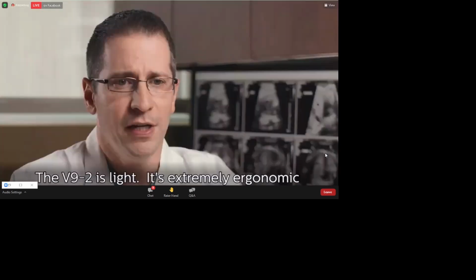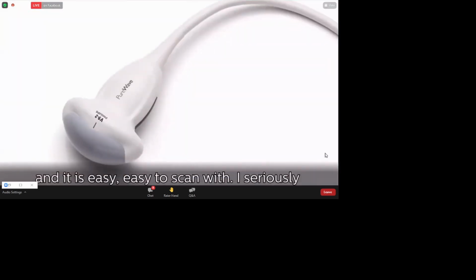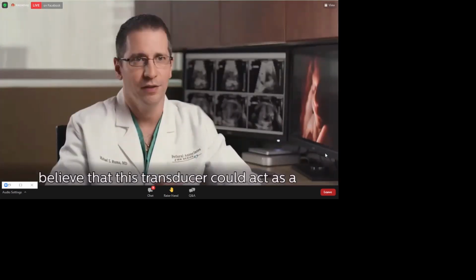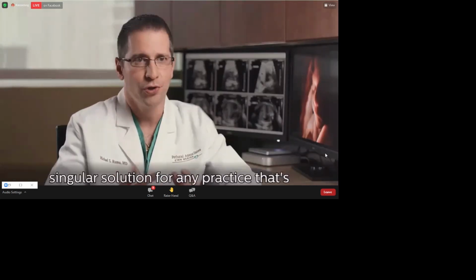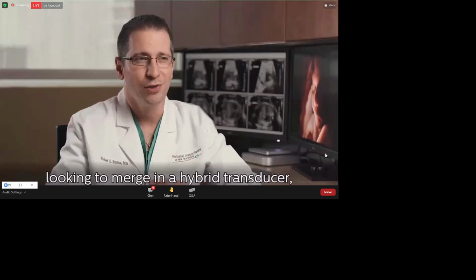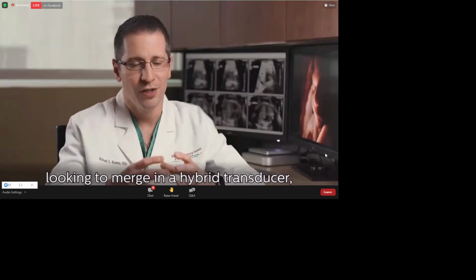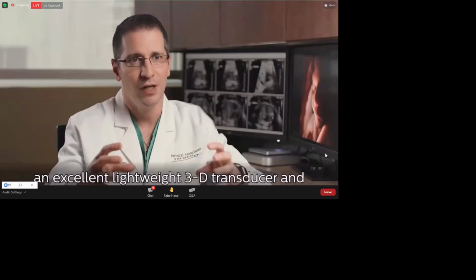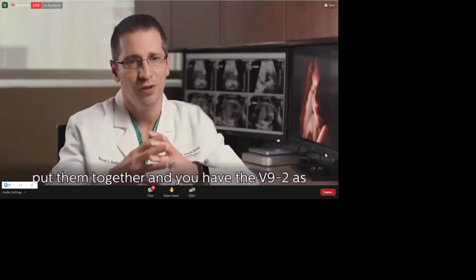The V92 is light, it's extremely ergonomic, and it is easy to scan with. I seriously believe that this transducer could act as a singular solution for any practice that's looking to merge in a hybrid transducer, both a 2D high-frequency transducer and an excellent lightweight 3D transducer, and put them together, and you have the V92 as a wonderful solution for that person.